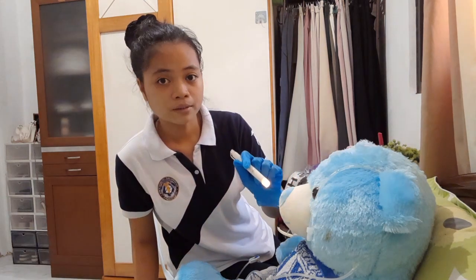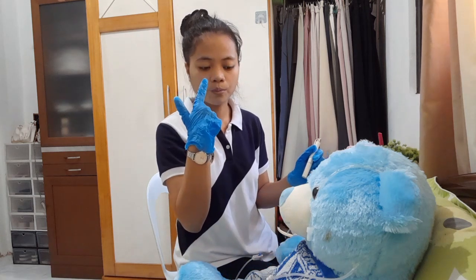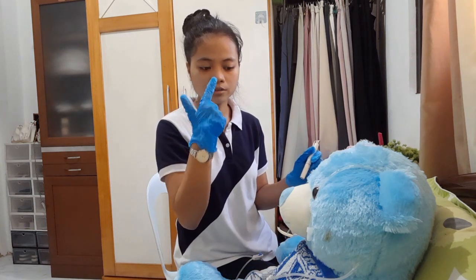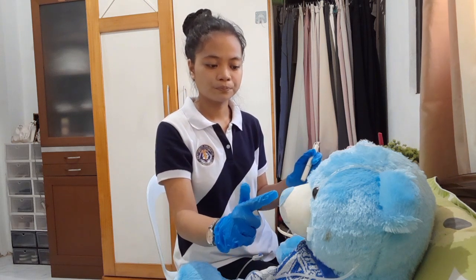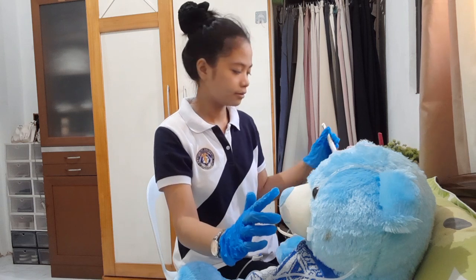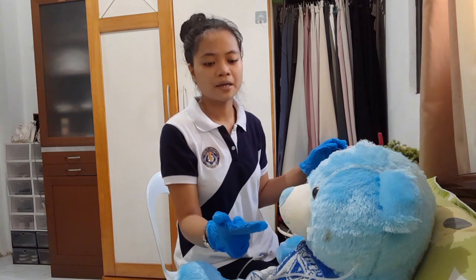You can examine na muna. Then ask the client to close the one nostril or the one nose. Then this is applicable only for conscious patients.